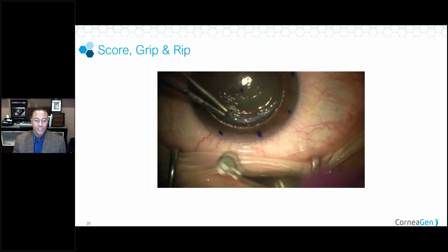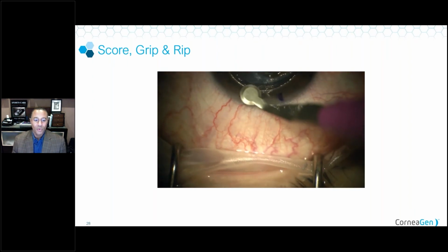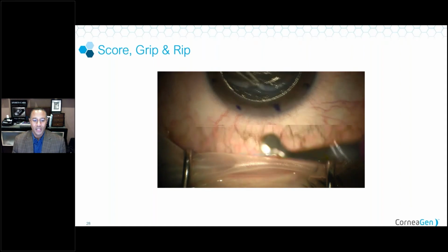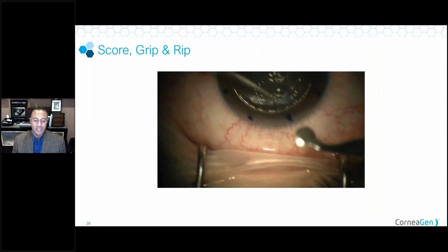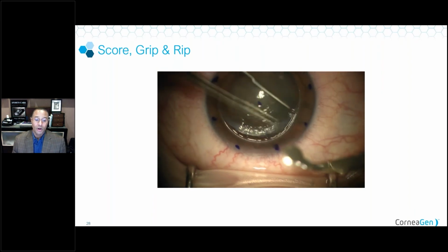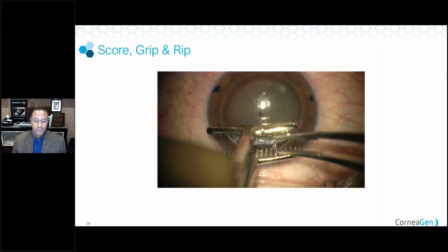Here, we're going to take 0.12 and our feather blade, and we're going to score. So we're just trying to make a nick. I used to dissect into the peripheral cornea about 1 or 2 millimeters. It's really not necessary. All we're trying to do, in the same way that you would score a glass tile if you're trying to break it, is weaken those peripheral fibers, because those peripheral fibers of the cornea, we know, both peripheral and superficial, are stronger and more adherent. The central and deeper fibers are less adherent. So here we're pulling a little bit just to make a little score.